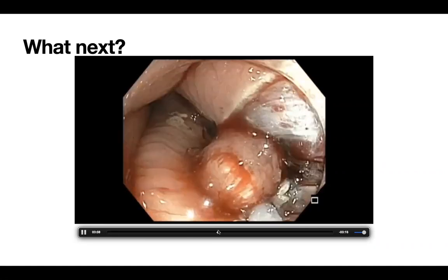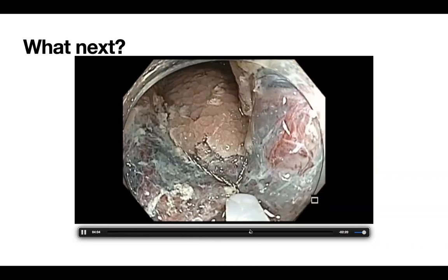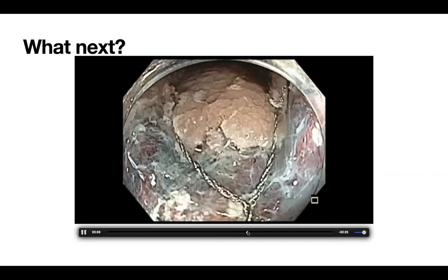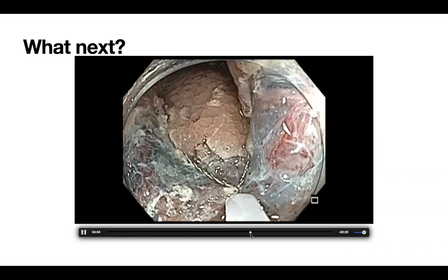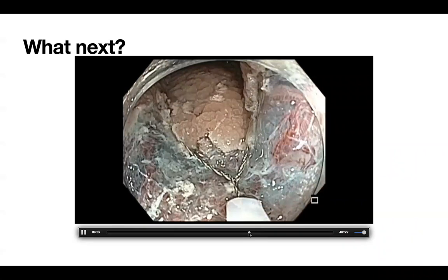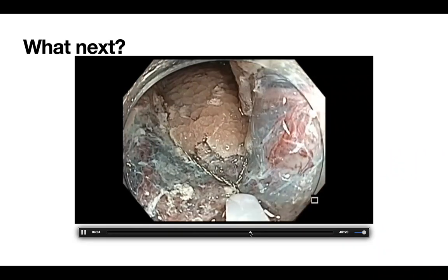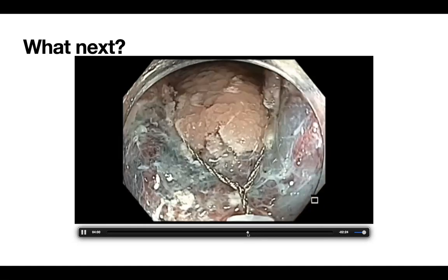All right, Sriram. It's beautifully done, sir. I agree, the snare is too far out. Exactly, that part is actually causing a fulcrum effect there, lifting the rest of the snare a little higher. That's what I was talking about. Because of that stem of the snare, it should not be extending out of the plastic catheter. That's just for quality improvement sake for our own.